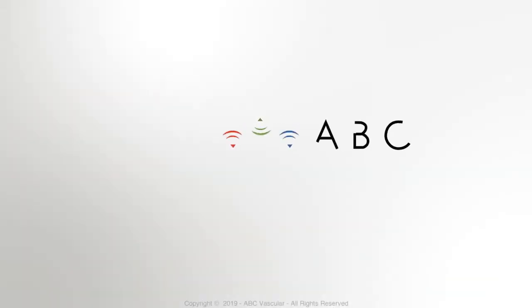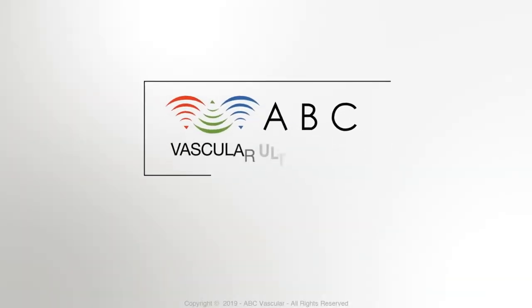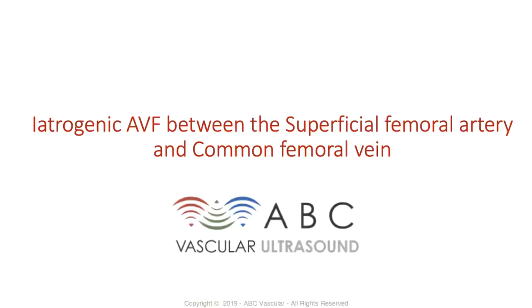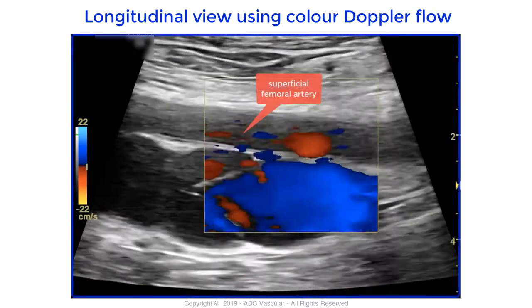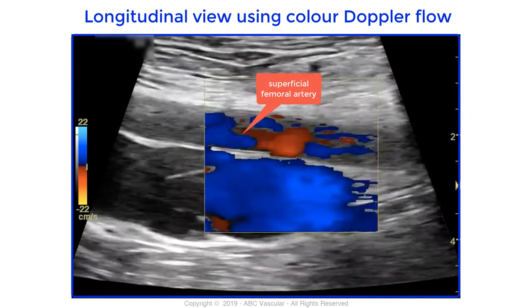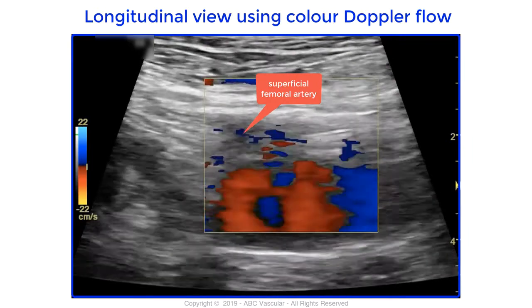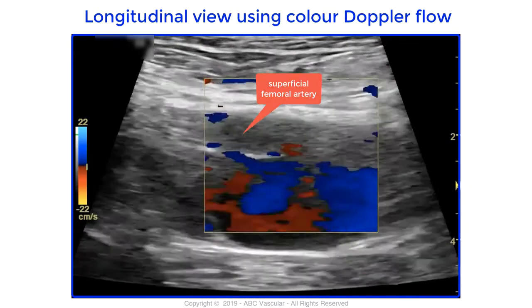Welcome to this ABC Vascular Ultrasound case study on the iatrogenic arteriovenous fistula between the superficial femoral artery and the common femoral vein. In this longitudinal view using color Doppler flow, you can visualize the superficial femoral artery anteriorly to the common femoral vein.